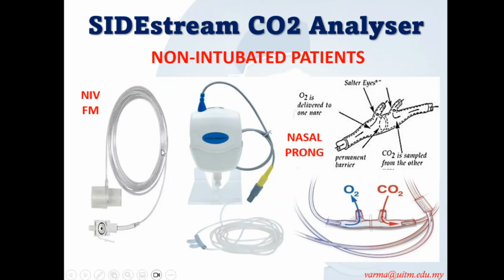Or where we have this, you see in some of the ICUs we have this ETCO2 sensor. If a patient has asthma, we say, can you please tell the nurses to connect the Capno? They will bring this and connect, and they'll bring the sampling tube and connect to the ETT. Or in a patient who has nasal prongs also, we have a special nasal prong. That special nasal prong allows oxygen to go in on one side, and carbon dioxide to come in on the other side. It is called Salter, S-A-L-T-E-R, Salter eye. So this is the nasal prong, specially to monitor CO2.